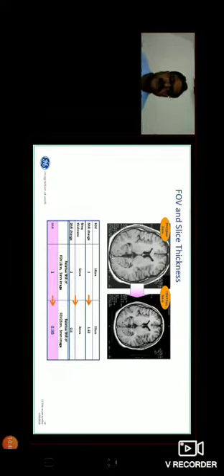So altogether, the relative SNR is almost the same, only 0.2% difference. You can see there is not much SNR difference. There is not much blurring. Spatial resolution is not affected much because I reduced the slice thickness, and I am keeping almost the same SNR.